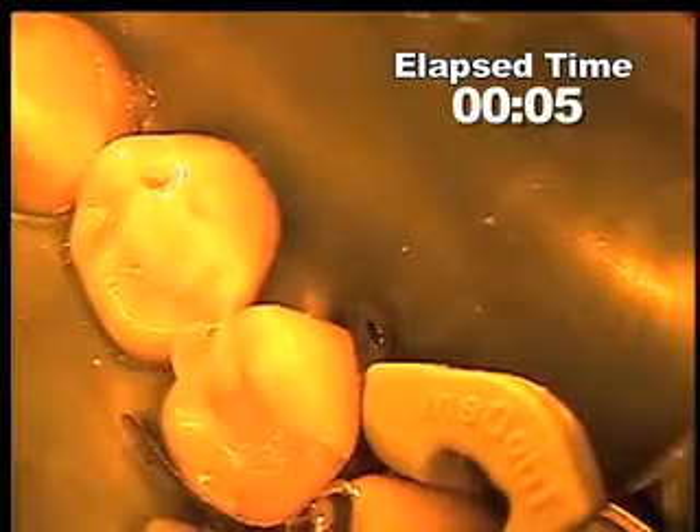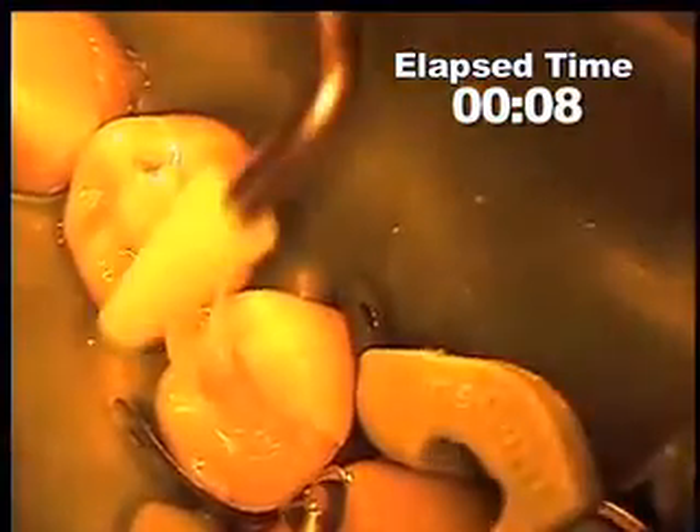I'm going to initiate this. This will be a very, very rapid procedure and the cavity fills up literally like that in seconds in a single bulk fill.